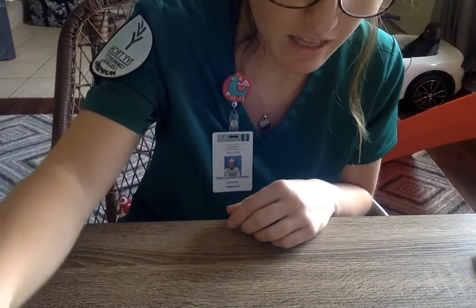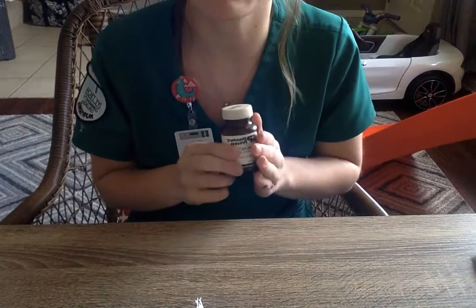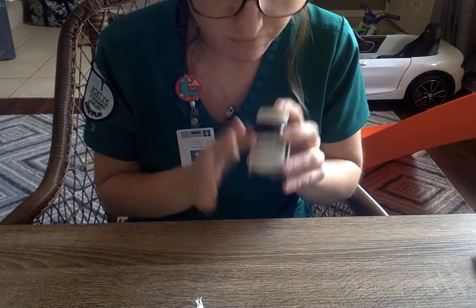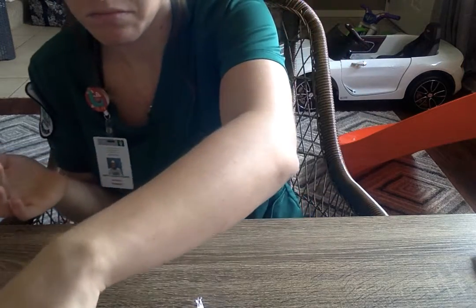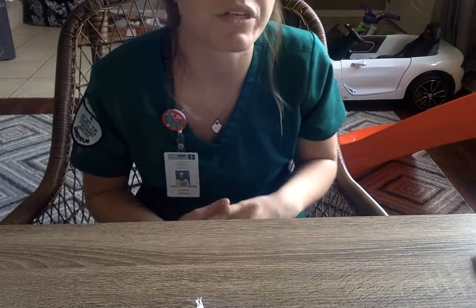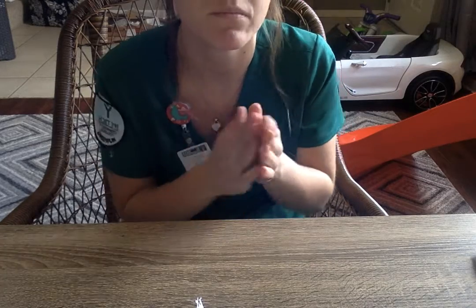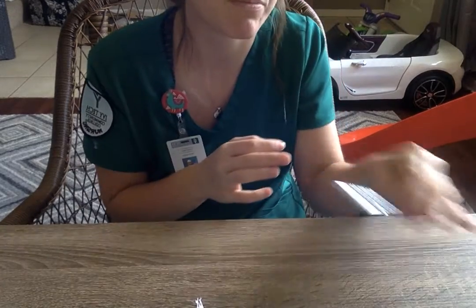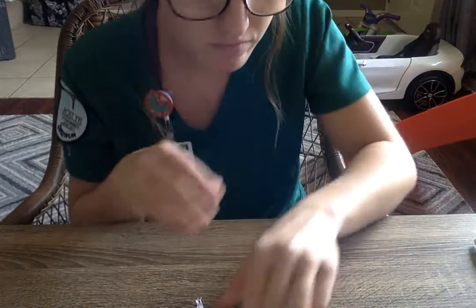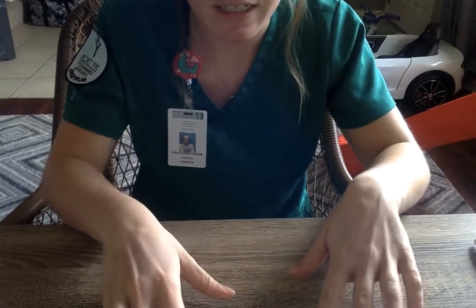Okay. Also too, if this was a multi-use vial of insulin, I would make sure that I dated and initialed it. Also too, since this is Humalog, which is insulin, I am going to have a second nurse check everything from the MAR to the order to the preparation to me actually administering the medication. Okay. Turn my MAR over.